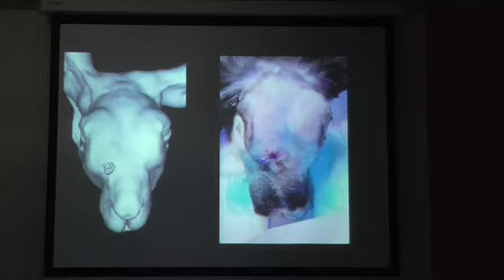Spikes are sometimes really a big problem for intraoral radiography, because when you put the intraoral plate inside the mouth cavity and there is a really sharp spike, you could damage your dental film.